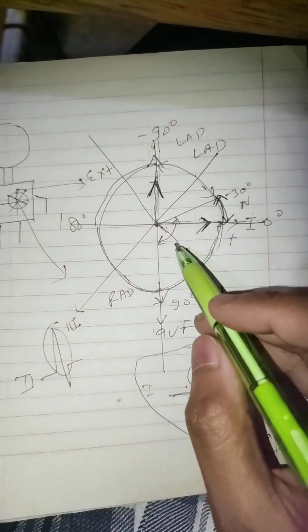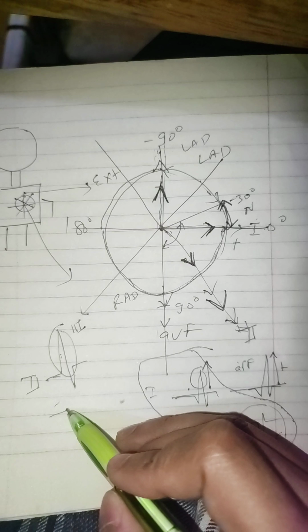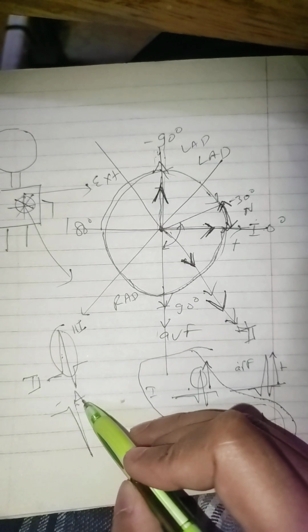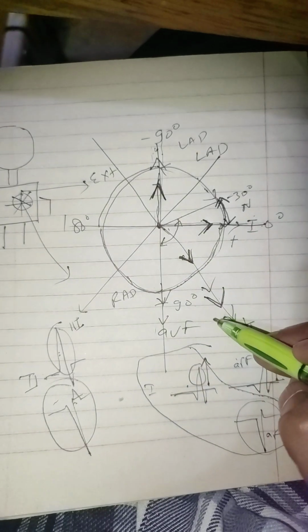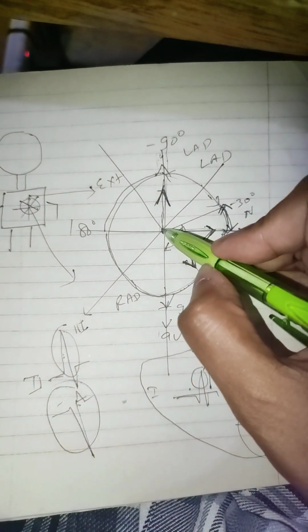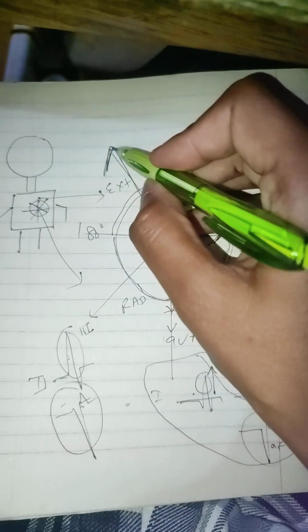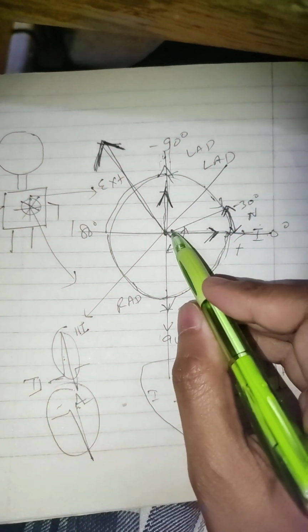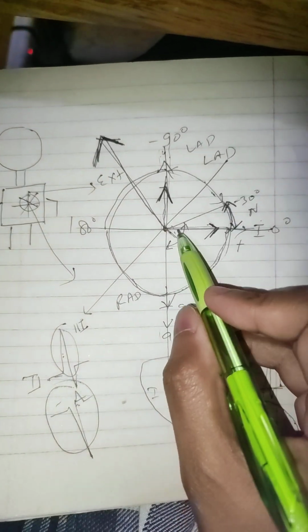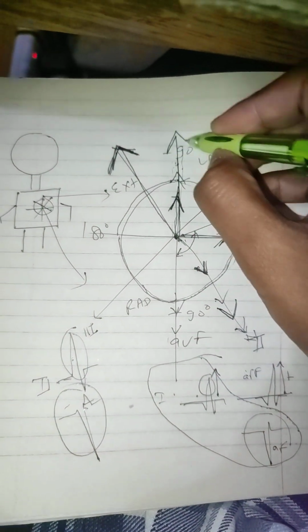But let's say lead 2 is predominantly negative, like this. If it is predominantly negative, then the predominant vector will be in this direction, right? So lead 2 is directed in this direction and lead 1 is in the positive direction. AVF is in this direction, right?